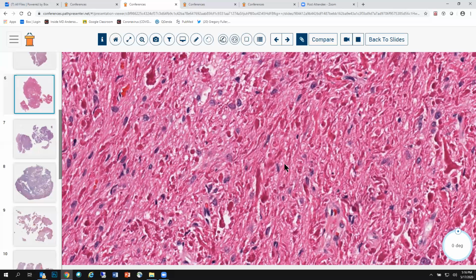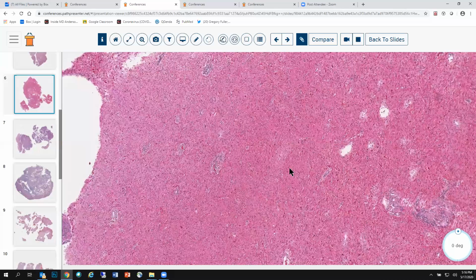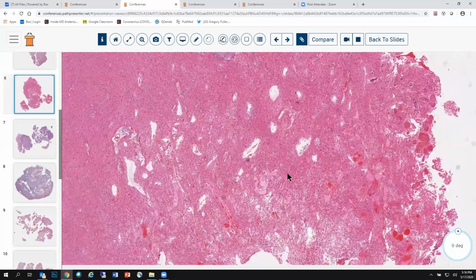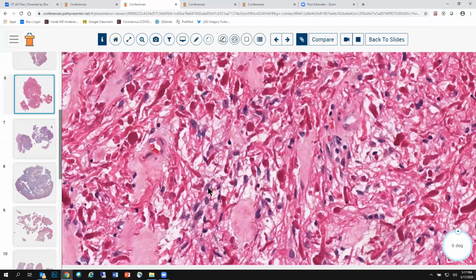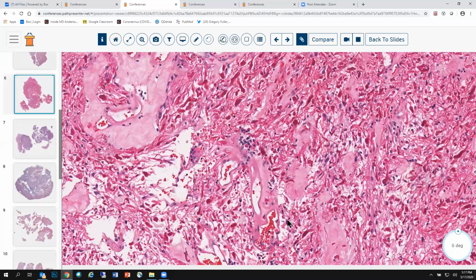Neoplastic Rosenthal fibers: pilocytic astrocytoma, pleomorphic xanthoastrocytoma, ganglioglioma, those 3 entities. And then genetic metabolic, genetic disease, that would be Alexander disease. All right, now in this particular case, we're going to look around, and what we're going to see as we survey different areas is clearly this has a glioma look to it. It's pilocytic. You see these elongated nuclei in an area like this, bipolar cytoplasmic processes. This is pilocytic astrocytoma until proven otherwise.